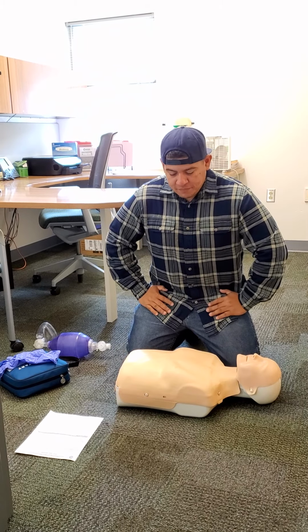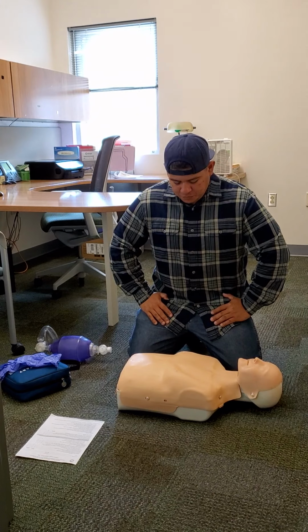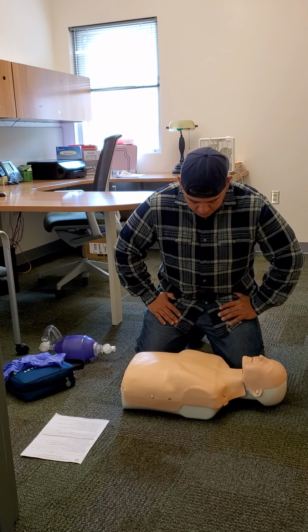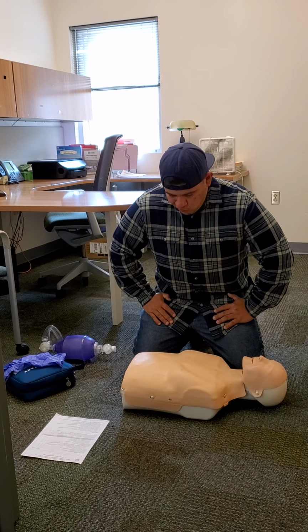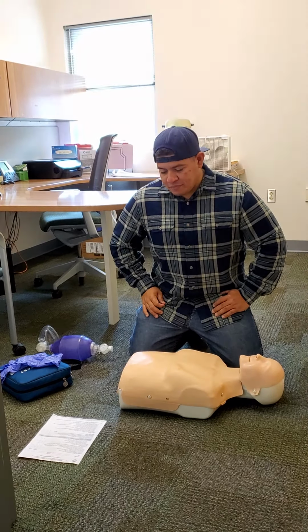Okay, this is the cardiac arrest management with AED skill sheet. This is a national skill sheet. There is no state skill sheet for cardiac arrest and AED. So this is the one that you'll be using in class and for testing purposes. This is Efren, and he will be going through the skill for you.